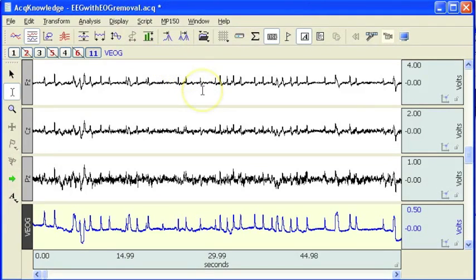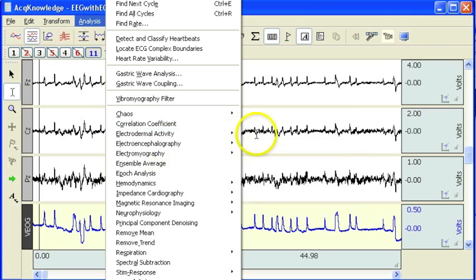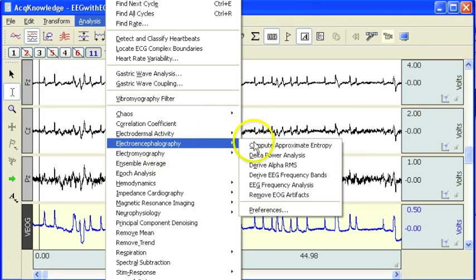In the following screencast, we'll take a look at Acknowledge's automated EEG tools. In this particular screencast, we're going to look at a routine that will automatically remove EOG artifacts from EEG data.